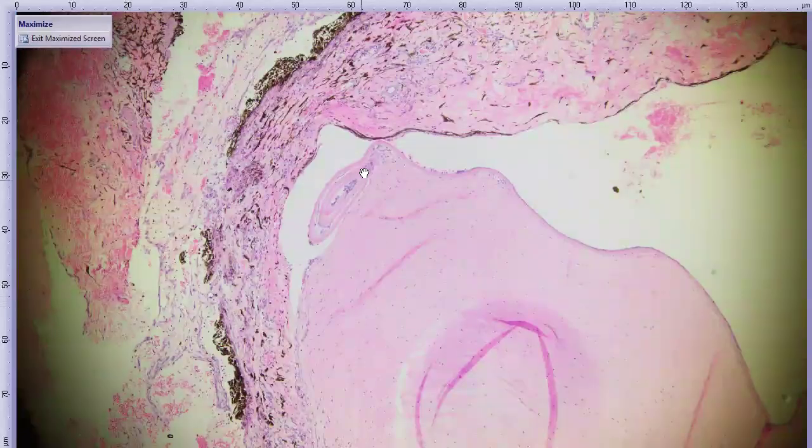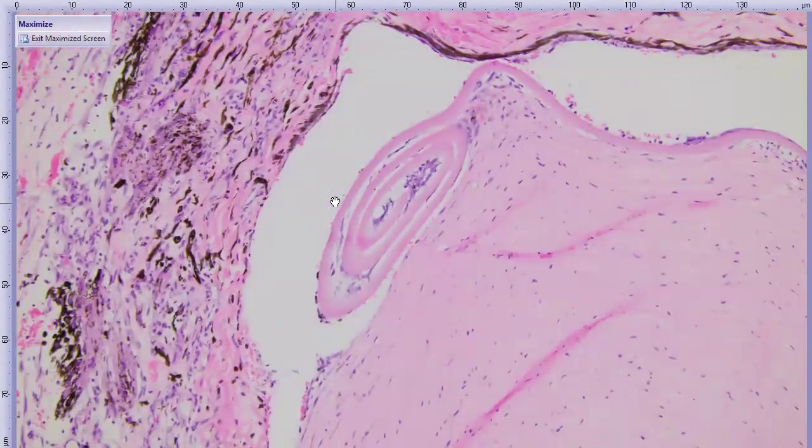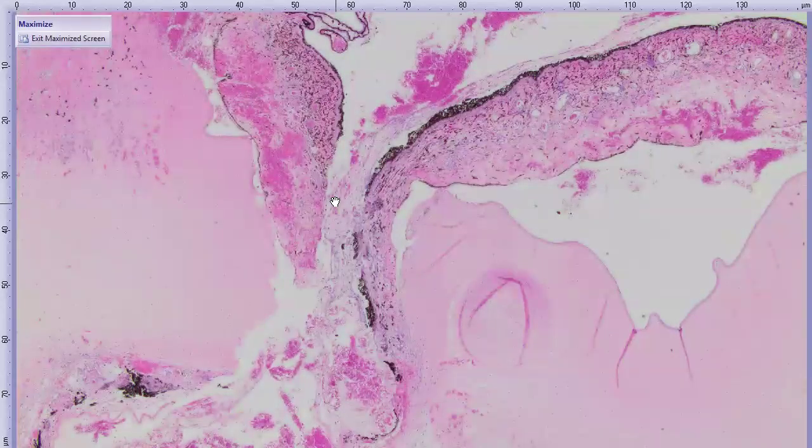We have this beautiful coiling of Descemet's membrane right here. I don't know if that necessarily implies anything about the etiology of a break in Descemet's membrane, but maybe you could imply that it's a high energy sort of trauma. I don't know if that really plays out, but Descemet's membrane is quite elastic, so I think when it suddenly is broken, it can coil like that. Same with the lens capsule.